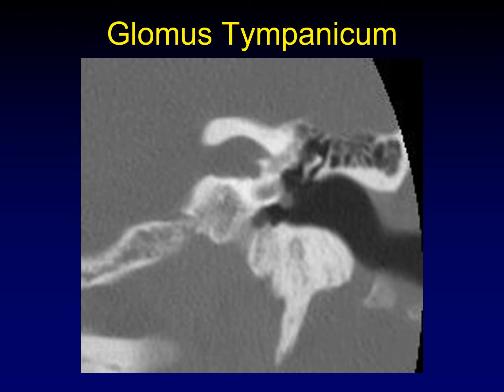Glomus tympanicum tumors arise from Jacobson's nerve, which is a branch of the ninth cranial nerve. They arise in a very specific location on the cochlear promontory. This coronal CT shows the cochlear promontory overlying the basal turn of the cochlea, just beneath the internal auditory canal. This round object here is a glomus tumor in its characteristic location — these are called glomus tympanicum tumors.